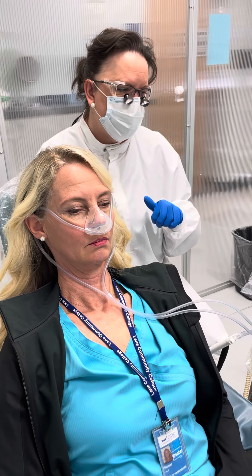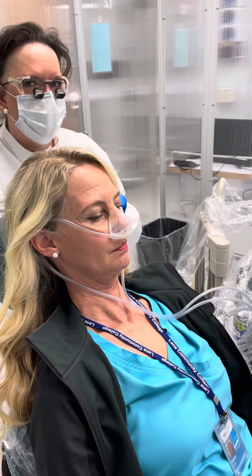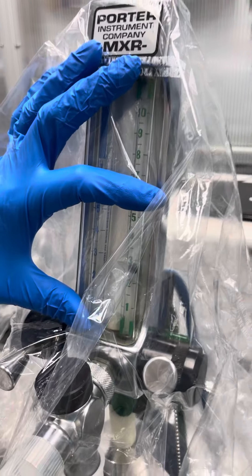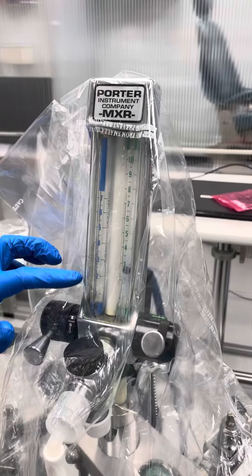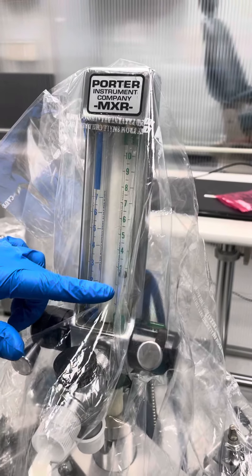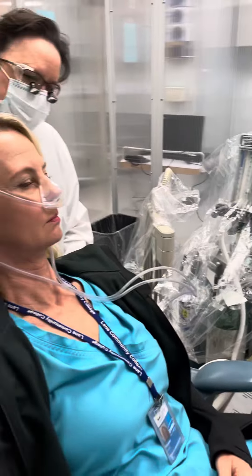Now we're finished with the nitrous induction, and the patient is sitting here waiting for the five minutes of post-treatment oxygenation. I went to the tail end of that, so she's got three liters of oxygen still going. I did increase it a little bit after we titrated down from the nitrous to get back up to three, because once we got down to the low nitrous, our oxygen was at a lower level. So five minutes has passed.